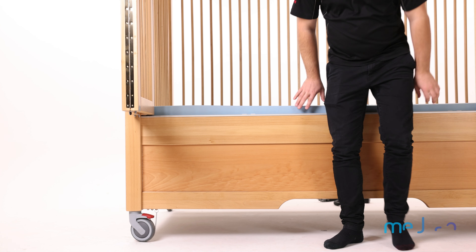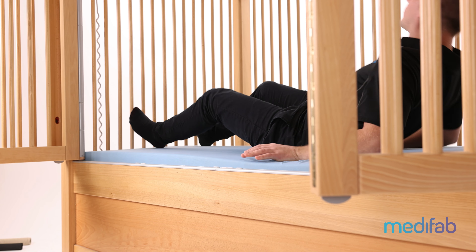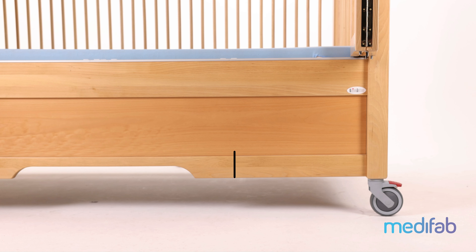Typically, those who use a safe surround bed would also be able to self-transfer into bed. The measurement from the floor to the top of the mattress is 53 centimeters.